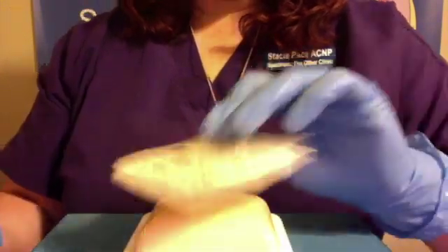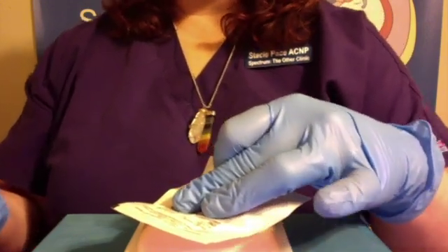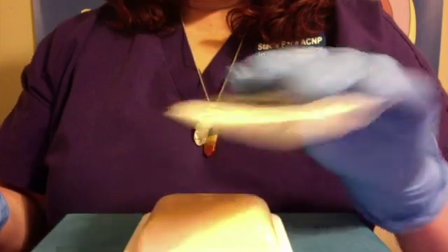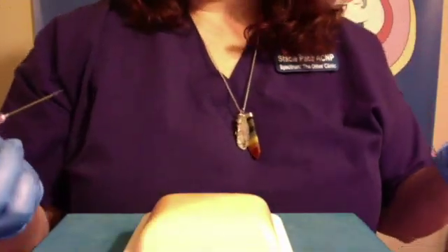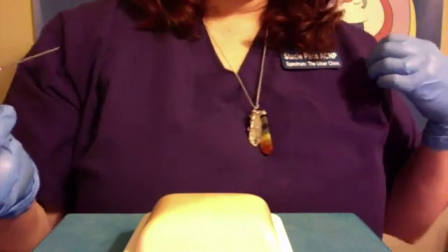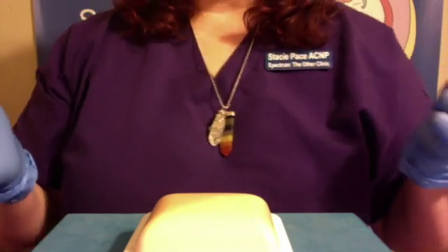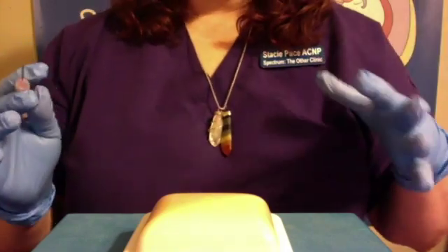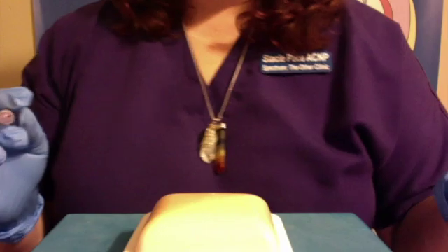Grab your alcohol wipe and apply pressure for about 30 seconds or more, depending on if you're a big bleeder or not. Then you can apply a little band-aid or whatever you want to do. To dispose of a needle, you can either purchase your own sharps container, or you can use a gallon milk jug or a two-liter bottle. Just make sure if you use a milk jug or bottle that you do label it so someone doesn't come along and throw it in the regular trash.